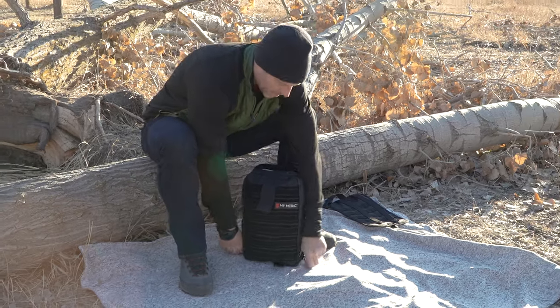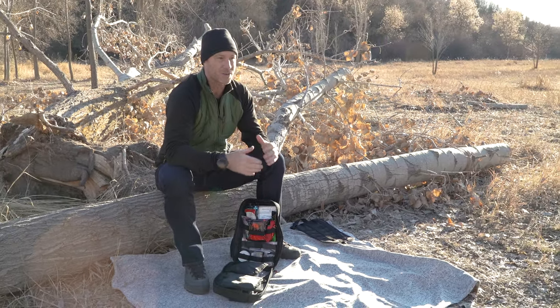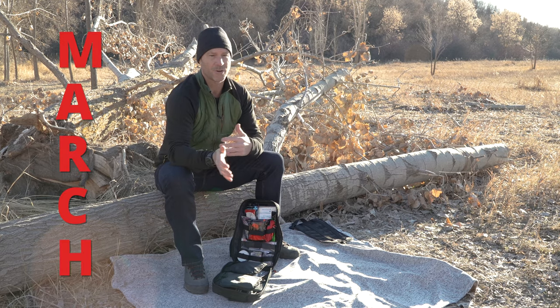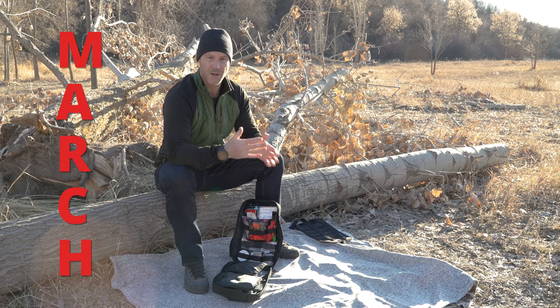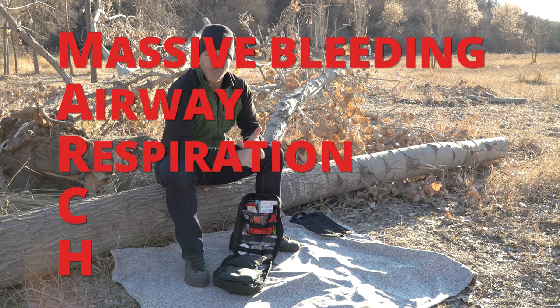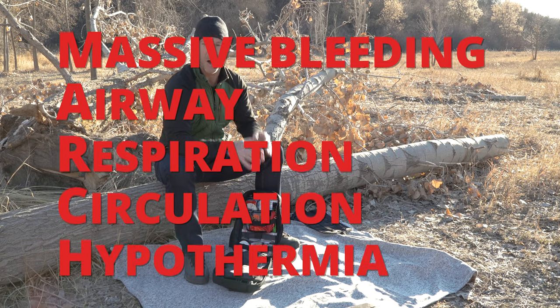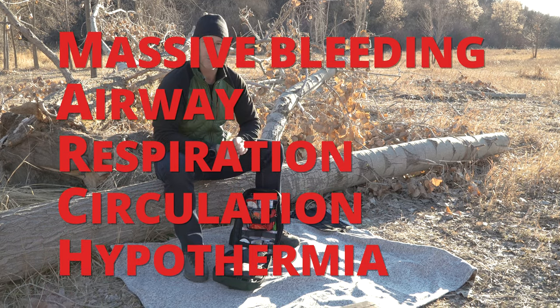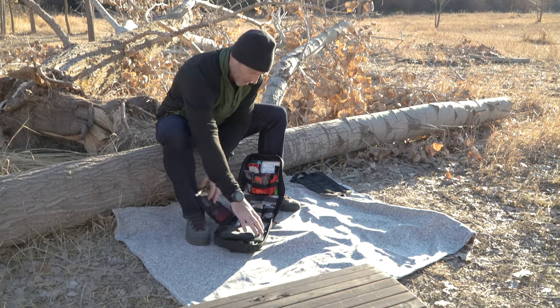It's got you covered from everything from boo-boos to blowouts. It covers the entire MARCH algorithm, which is what we use and base our first aid kits on. MARCH stands for Massive bleeding, Airway, Respiration, Circulation, and Hypothermia — all the life-threatening ailments that we have you covered with in this bag.